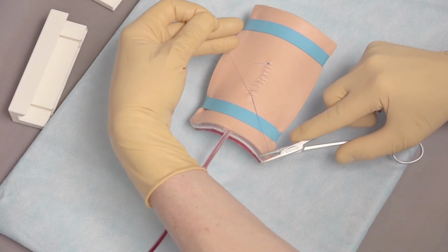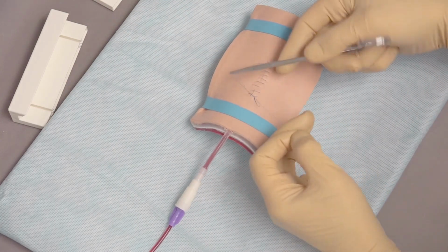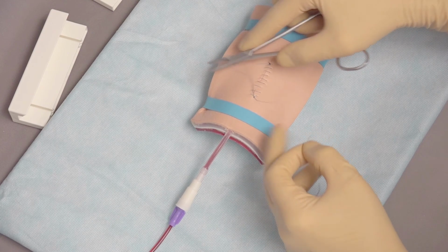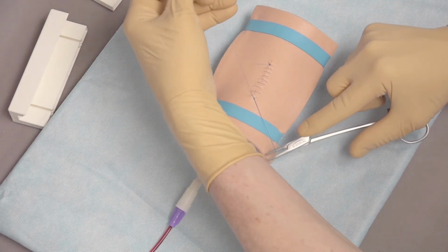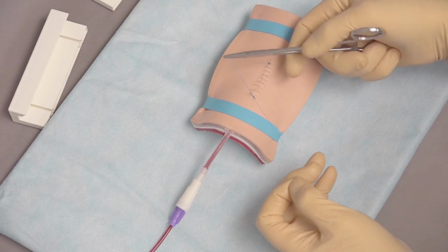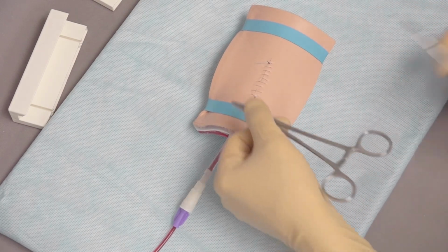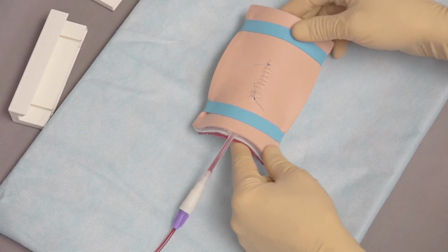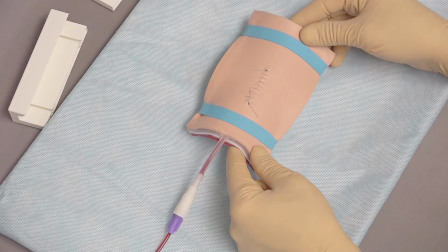tighten that down, making sure to open the jaws of the needle holder to allow the loop to equilibrate. And we're going to work on the other side, making sure we're nice and flat on this, the jaws open to equilibrate the loop. Four throws, and we should be good with closing this. So we've learned how to do hemostasis as well as suturing in this particular instance. And here you see, got a nice closure, fairly good even tension, and we're ready to go.